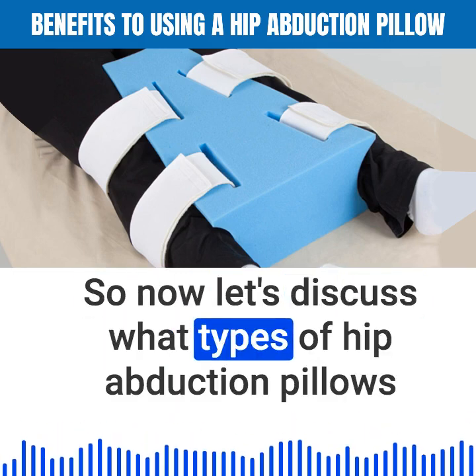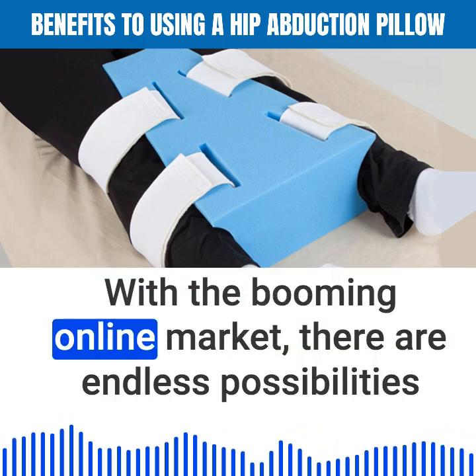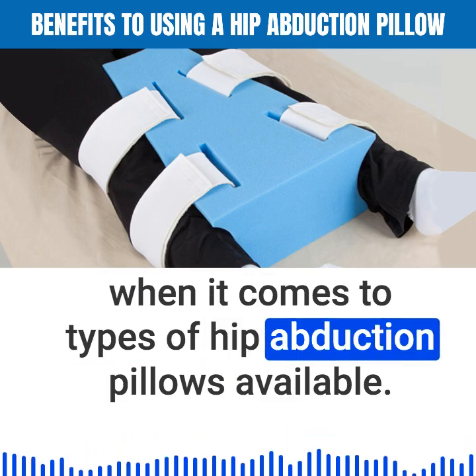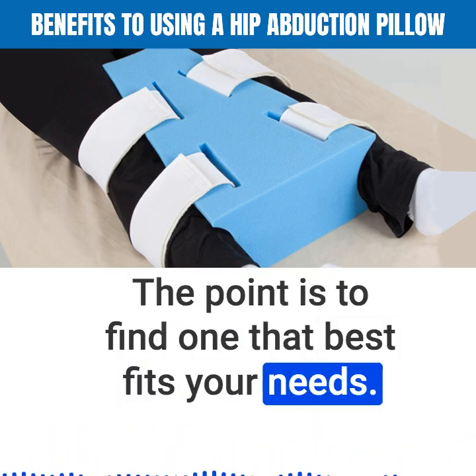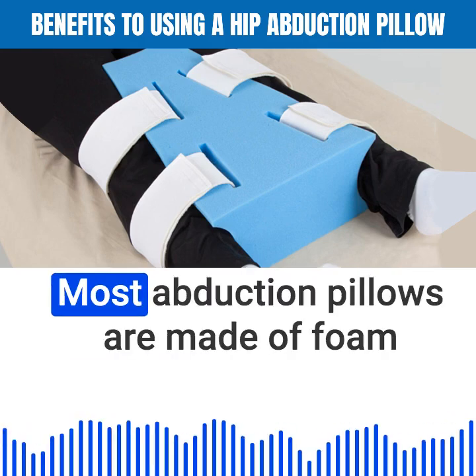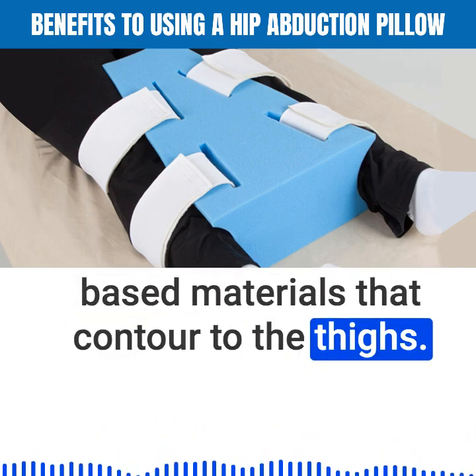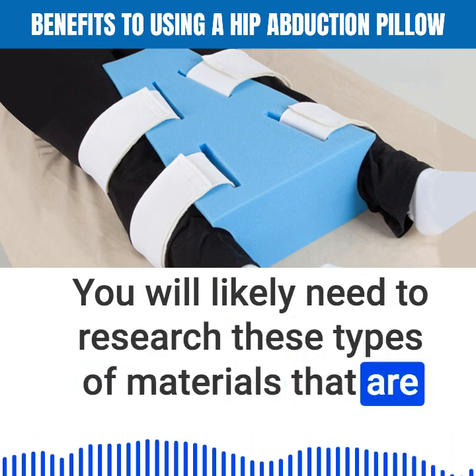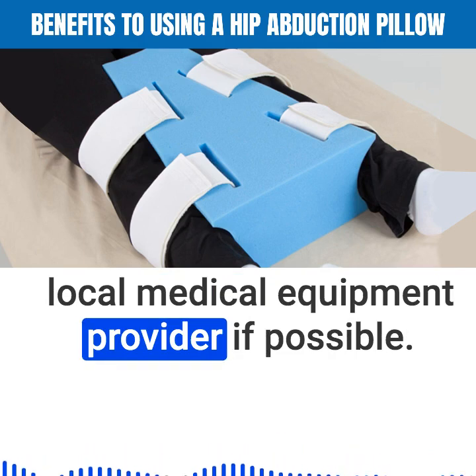Now let's discuss what types of hip abduction pillows are available on the market. With the booming online market, there are endless possibilities when it comes to types available. The point is to find one that best fits your needs. Most abduction pillows are made of foam-based materials that contour to the thighs. You will likely need to research these materials and do a test run with your local medical equipment provider if possible.